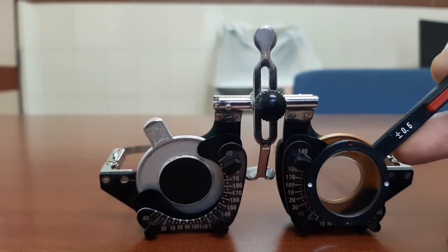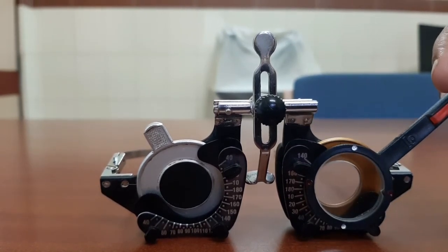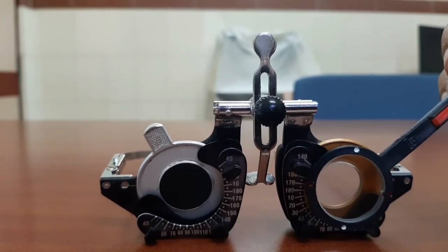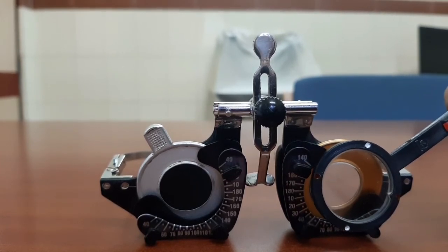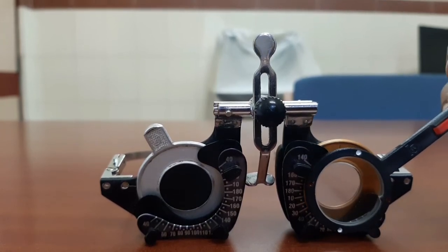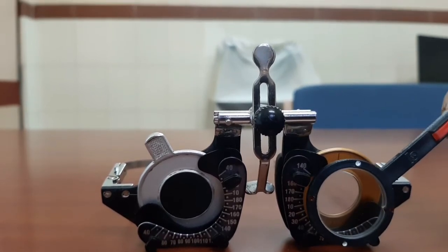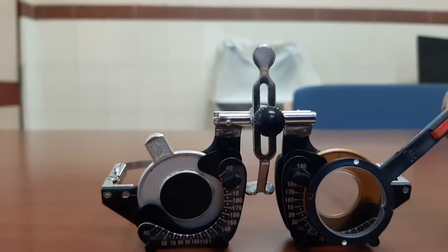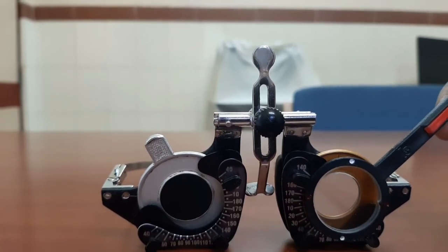That means increase the power of the minus cylinder. If the patient prefers the white dot side, reduce minus 0.5 diopter cylinder from the trial lens. Remember: for each 0.5 diopter cylinder added, add plus 0.25 diopter spherical lens to the trial frame to keep the circle of least confusion on the retina. Similarly, if adding plus 0.5 diopter cylinder, add minus 0.25 diopter spherical to the trial frame.